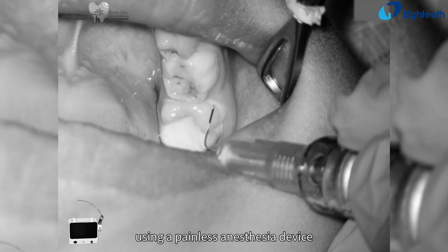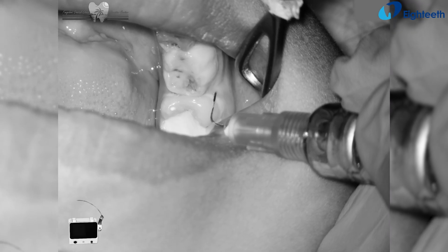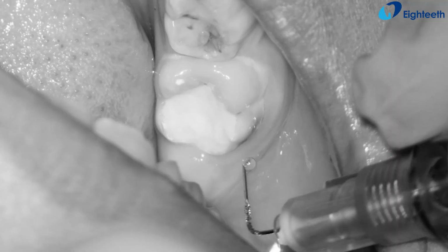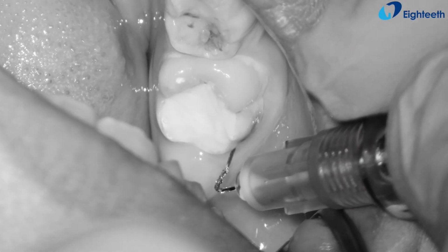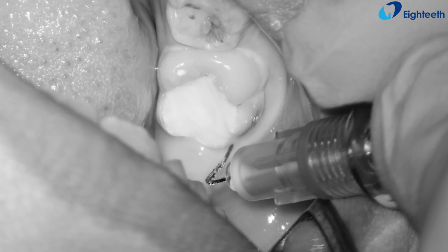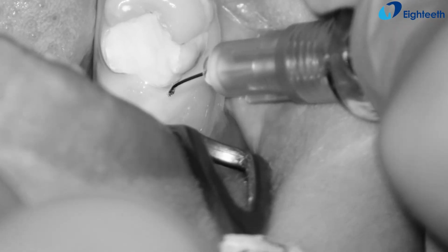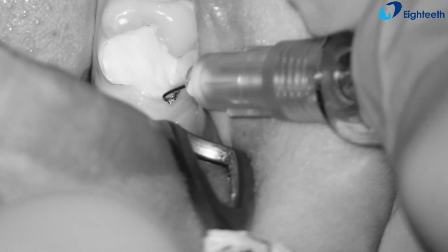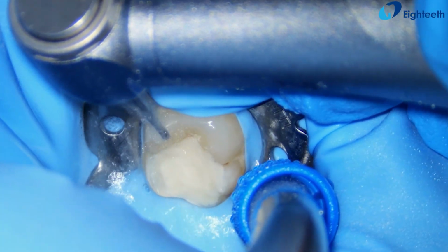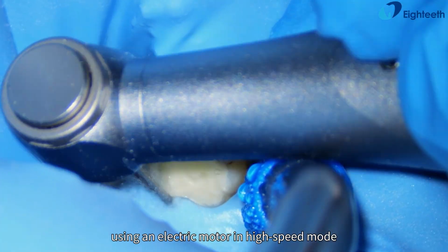Periodontal ligament anesthesia is administered using a painless anesthesia device. Carious tissue and temporary filling material are removed using an electric motor in high-speed mode.